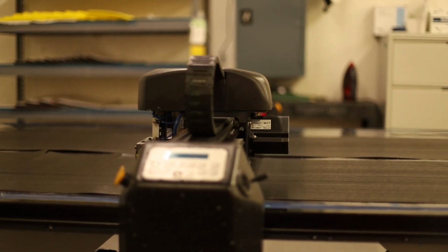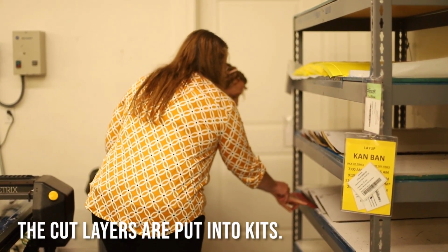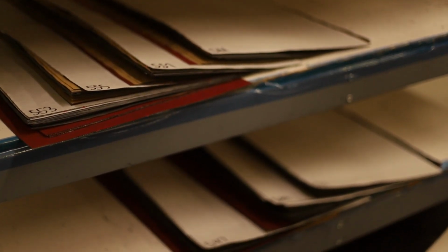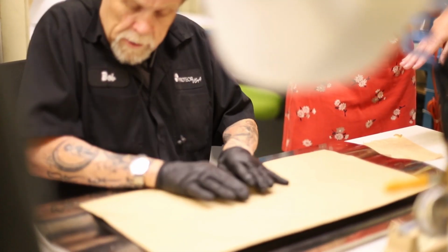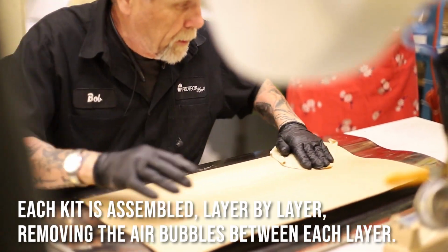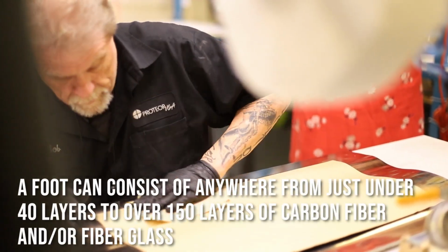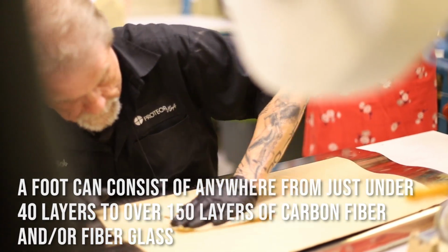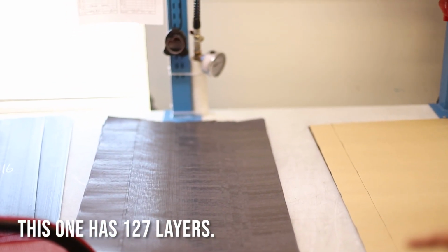So we'll kit it into the layers. We have all the different layers that go in the foot. There's the cloth on the outside, the woven, and then all the way through all the layers for the whole foot. And we have it in a kit, and these are all just the fiberglass for the rush feet. And then these are the different carbon feet. Roughly 127 layers. These are the 90, so I can bend better.